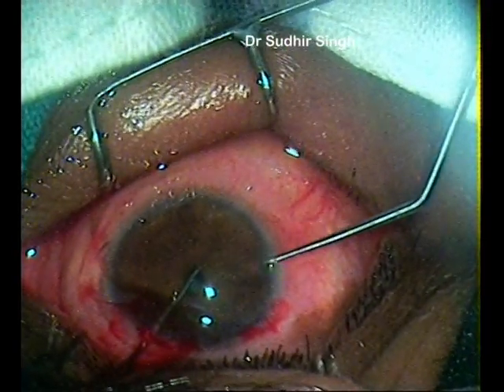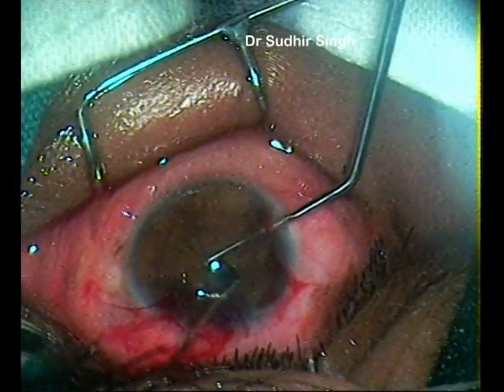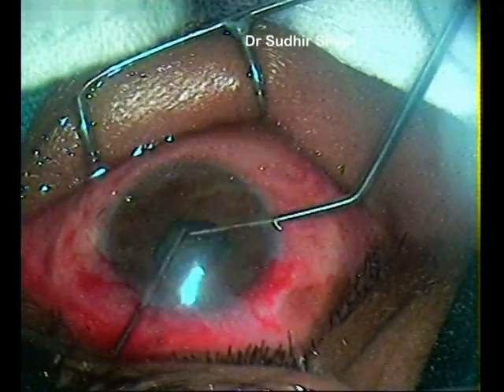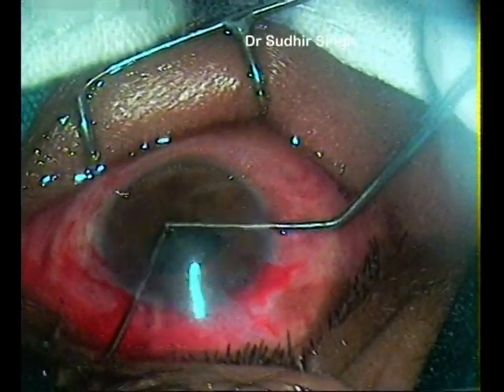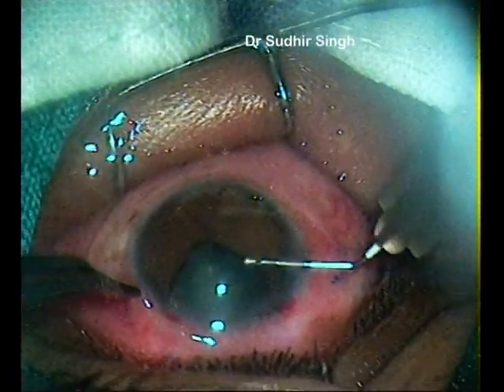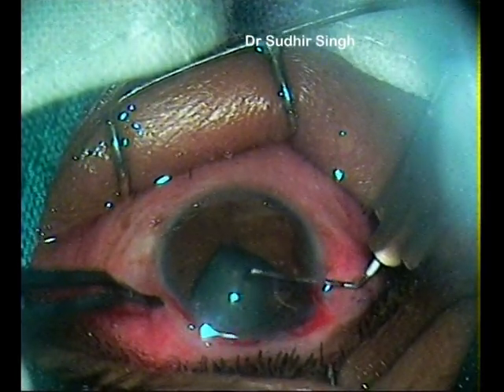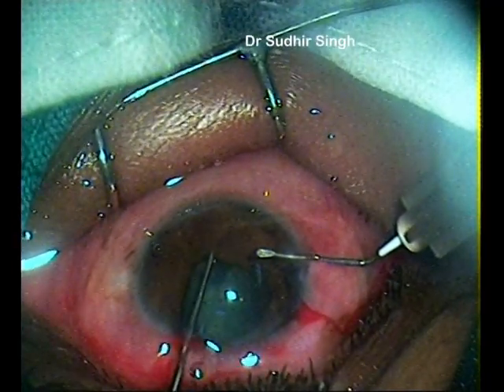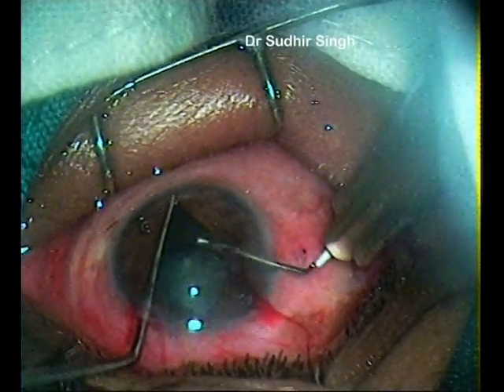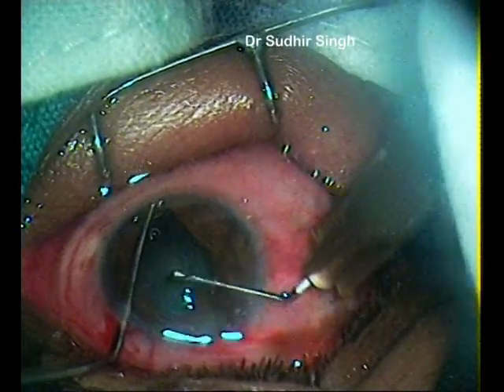This is a one millimeter elastic pupil, so the pupil is stretched by two lens hooks. The anterior chamber is formed by hydroxypropyl methylcellulose viscoelastics; other cohesive viscoelastics may also be used to give extra viscodilation of the pupil. Capsulorhexis is made by a 26-gauge cystotome from the right-hand side port, while simultaneously the pupillary margin is kept stretched away by a Y-shaped lens dialer entering through the left side port. About five millimeters capsulorhexis is made in this case.